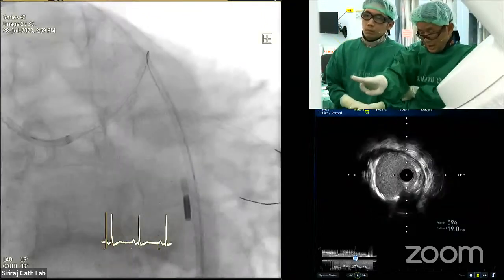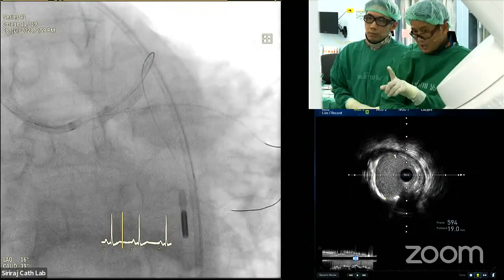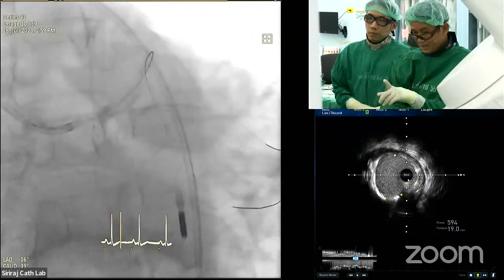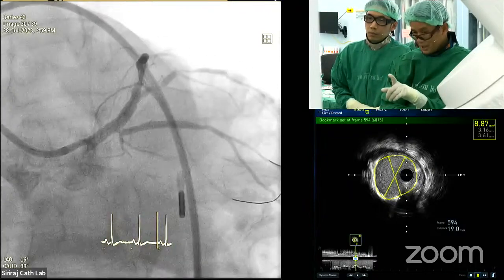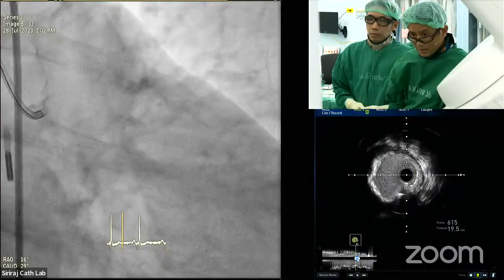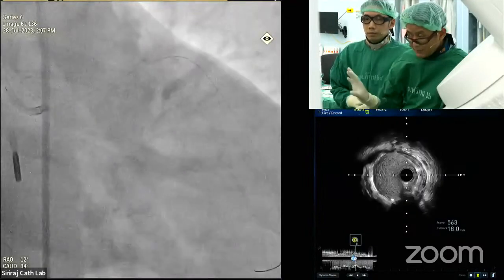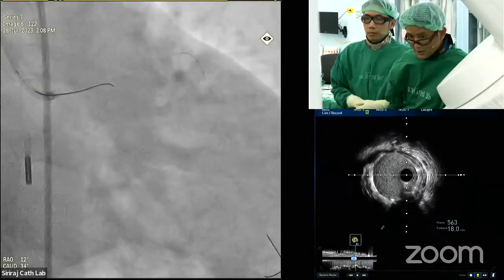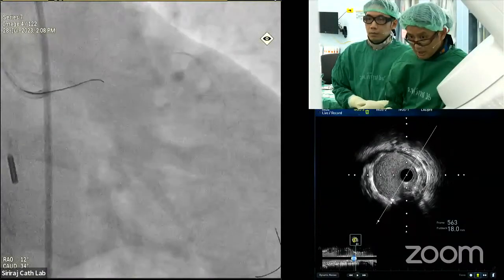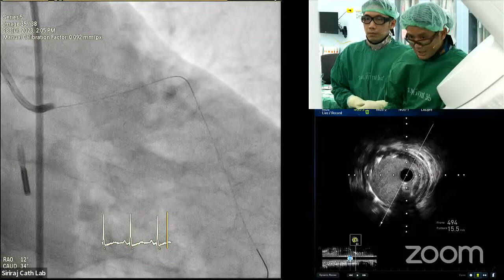This is the angiogram after the left main to LAD. The next question should be doing KISS in the circumflex. But the problem, based on the angulation on the previous view, I think it's a sharp turn. And I have the three disease and the ostium in the circumflex. So I'm thinking if I do the kissing, I might compromise and have to put in 2 stents, which in this case, I planned for a 1 stent technique.